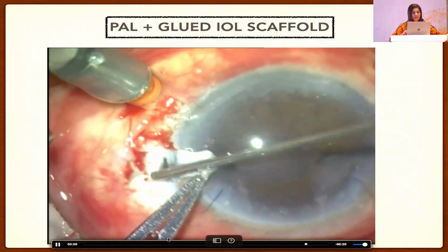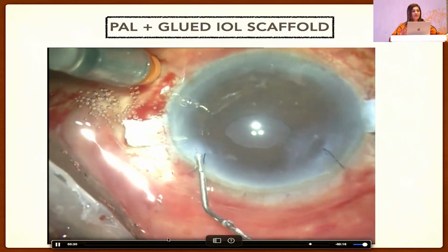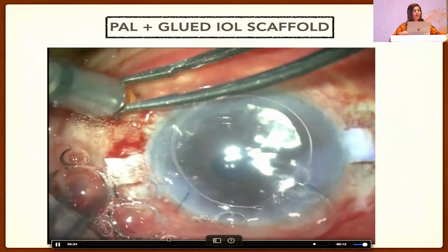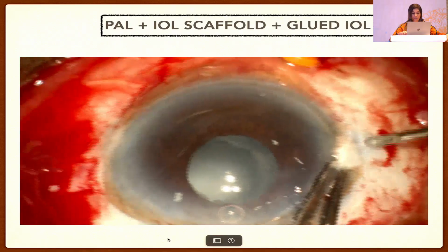Another principle is always seal the corneal wound whenever there is vitreous. You should never, even if you have done a good vitrectomy, leave the corneal incision as it is. You need to take a suture, seal things up, put on a fibrin glue, and do up the things.